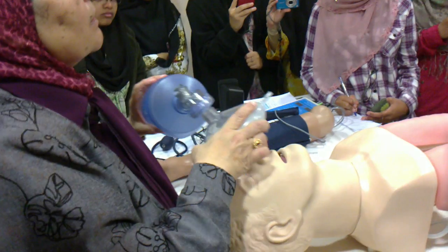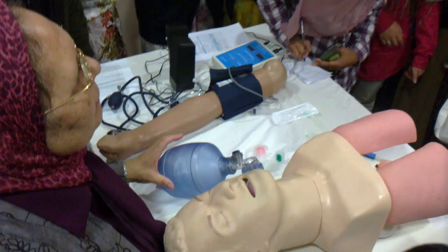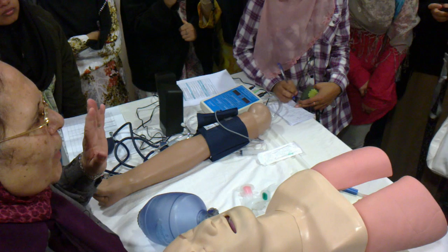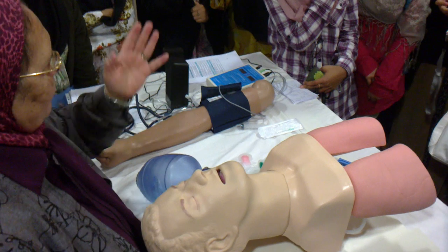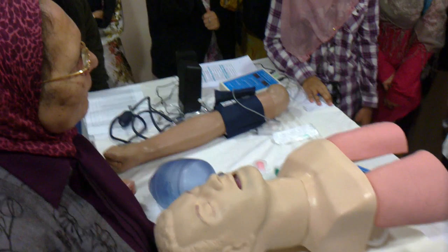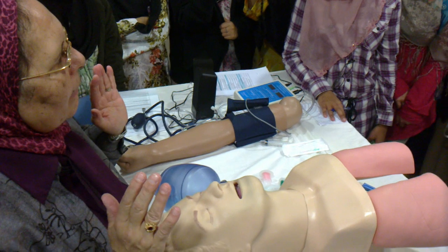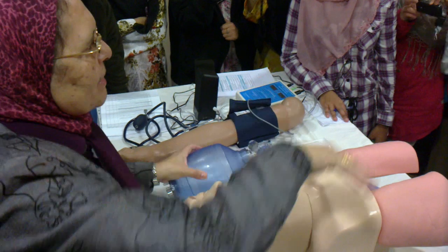Yes? What if our hand is small, so we can hold it, fix it? Do we have someone to... No. You are doing the skill alone. And if your hand is small, you can do it. Don't worry. Okay? This is the maneuver. Ventilation with the ambu bag. This is for this mannequin.